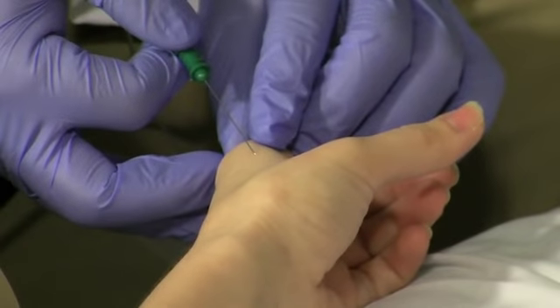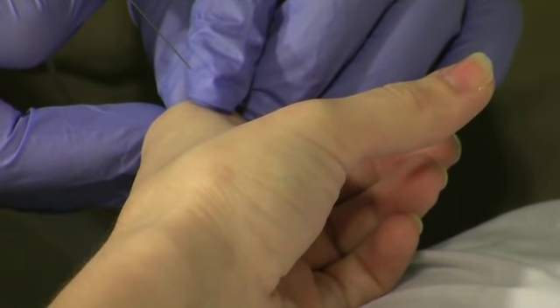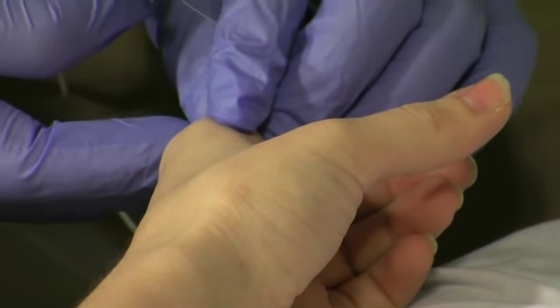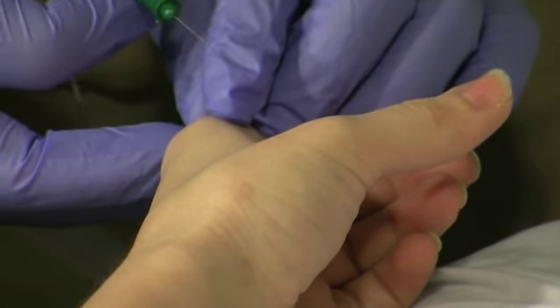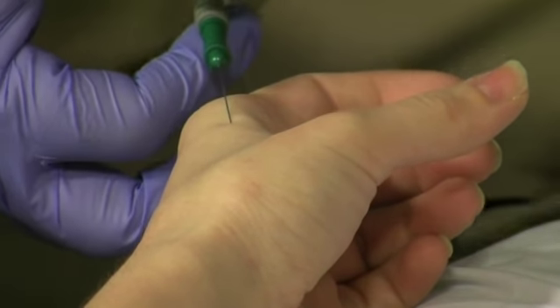So here we go. You're going to feel a stick here. By the way, the stick hurts only when it penetrates the skin. Once inside the muscle, it's going to feel like pressure. The painful part is when the needle penetrates the skin. Here we go. 1, 2, 3. That's it. And I'm inside the muscle now.